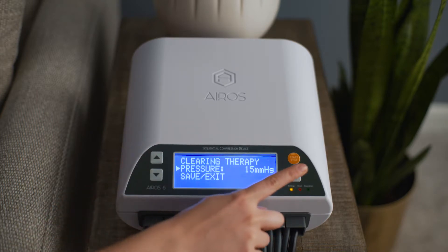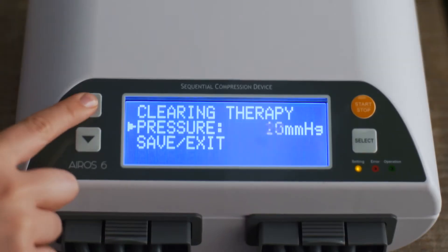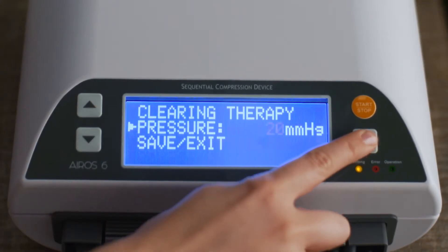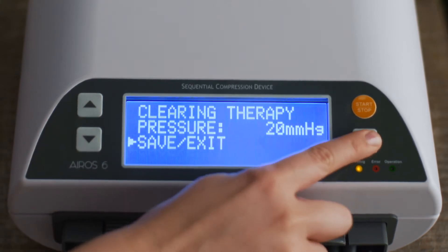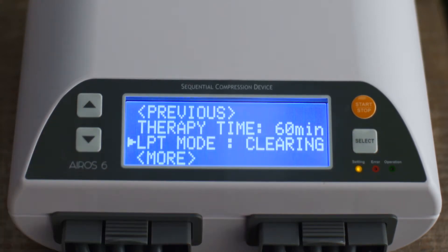To set the pressure, scroll to pressure and press the select button. Pressure can be set at 15 or 20 mmHg. Press the select button to confirm your selection. Then scroll to save exit and press the select button to return to the gradient mode setup screen.